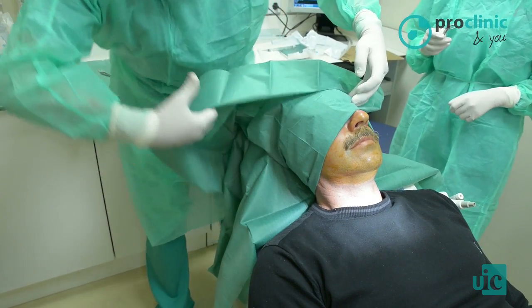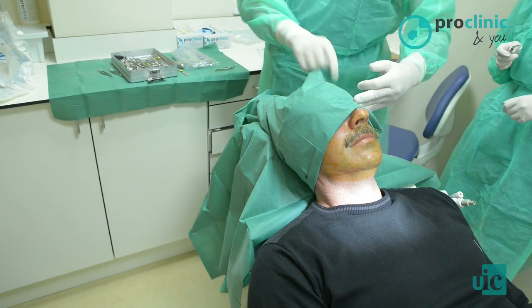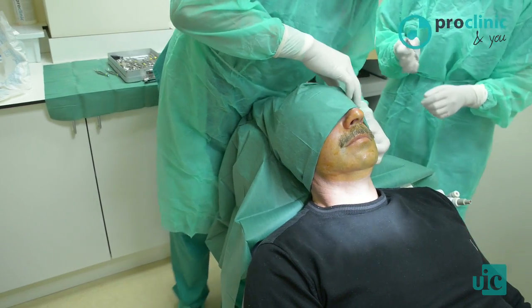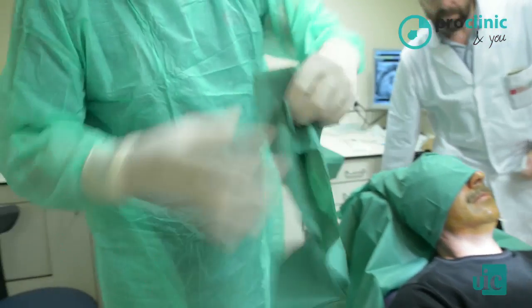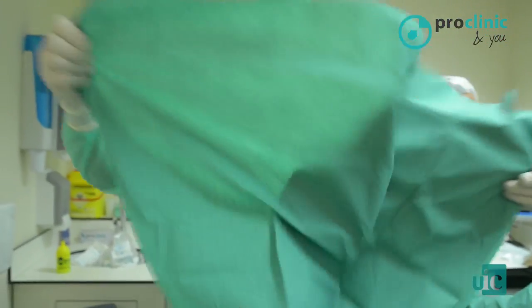This is the sterile part. And with a pin, we are fixing the towel. This is a turban towel, a capelina. With a bigger towel, we are going to cover the rest of the body.